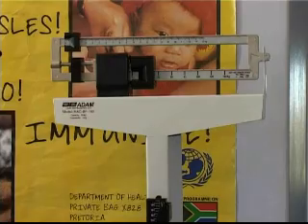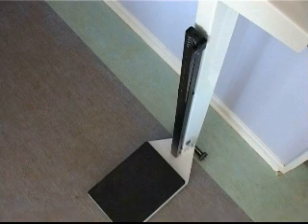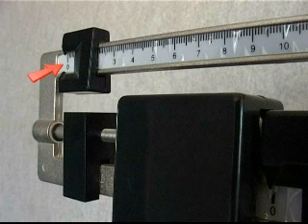To avoid inaccuracies, place the scale on a solid floor, such as concrete or tiles, and not on a carpet. Make sure that the scale is on level ground. Some scales have a built-in level indicator. In that case, adjustment screws at the bottom of the scale can be used to ensure that it is level. The zero reading of the scale may be affected when the scale is not in a level position.